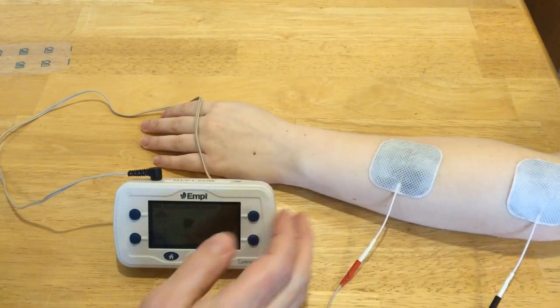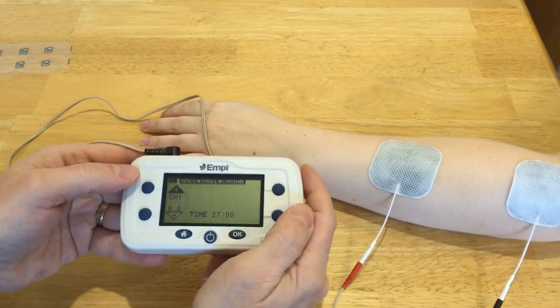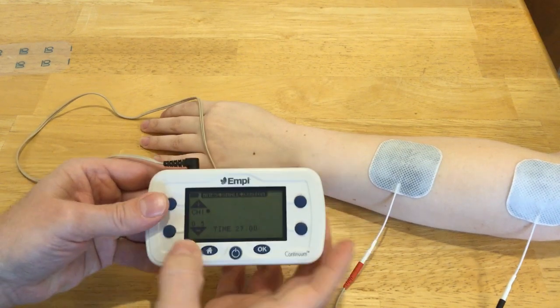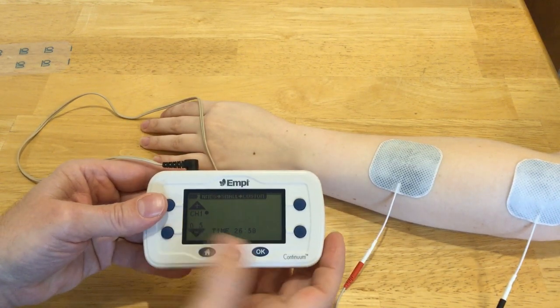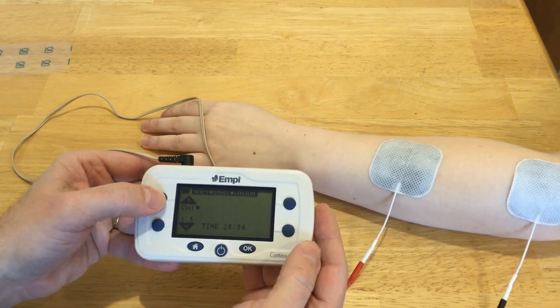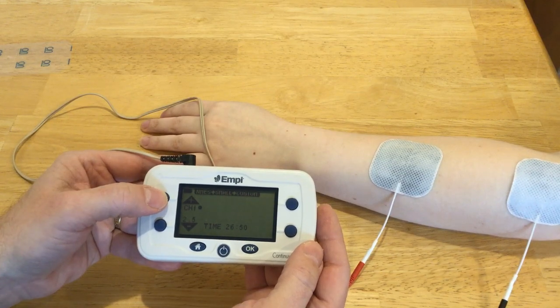So we're set with that, and I'm going to start to increase the intensity. You'll see the intensity is displayed right here. This little dot next to channel one means the current is on. You'll see that dot go away when it's doing its off time.